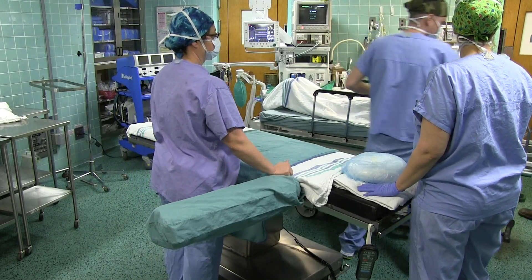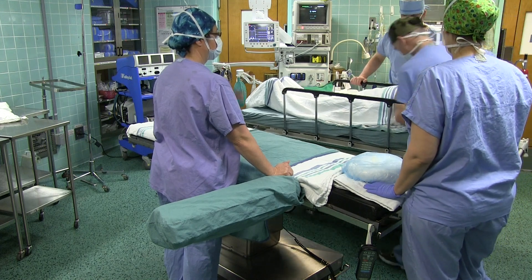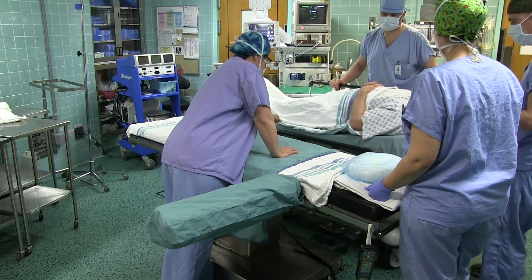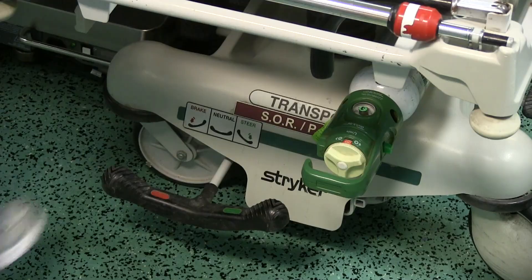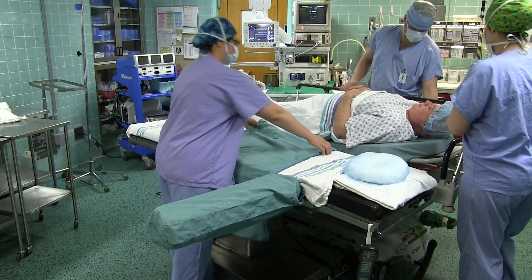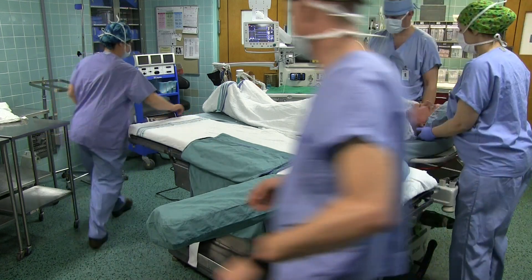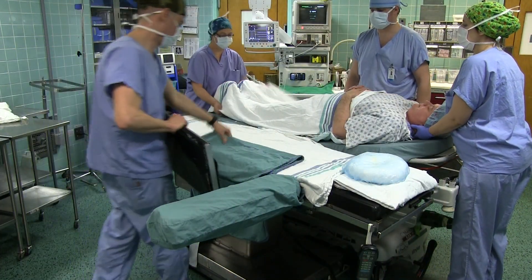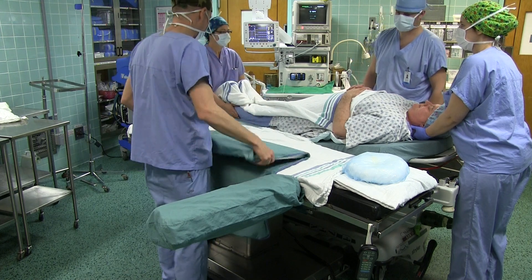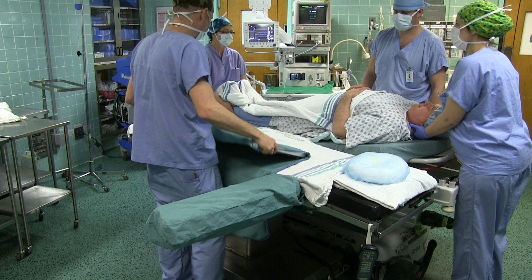Transferring an immobile patient to the OR bed or stretcher. In order to safely perform the transfer, four people will be required. The orderly will bring the stretcher parallel to the OR bed and lock it into place. The anesthesia team is always at the head and ensures that the OR bed is locked. A second orderly will be present on the opposite side of the patient, and another member of the team — for example, a nurse, resident, or medical student — will be at the foot.